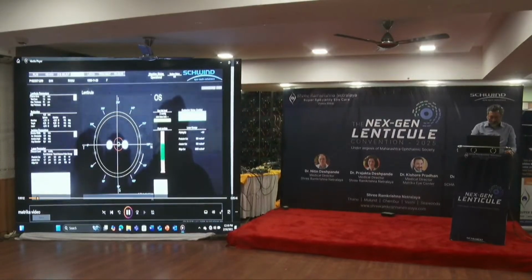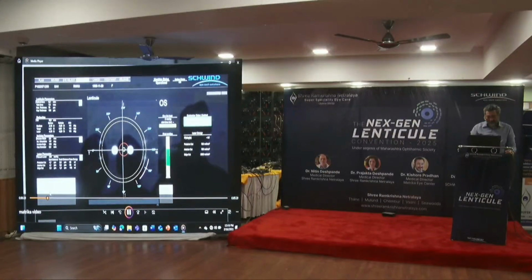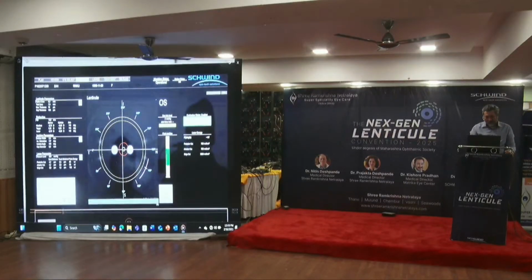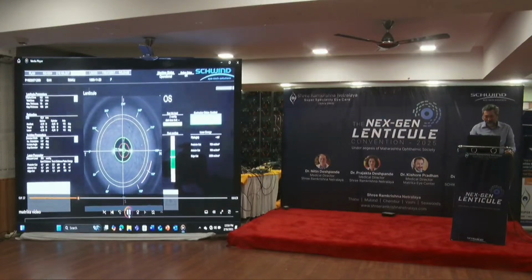Head, okay? Open your mouth and no matter what. So I'm going to put more and more anesthetics and I'm going to check how cooperative you are. I'm going to put more anesthetic. Check, always looking straight. Whatever she has touches the eye, you'll feel a little pressure. I want you to look 1 millimeter.